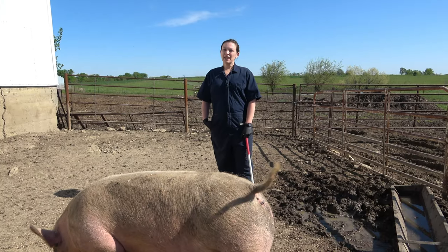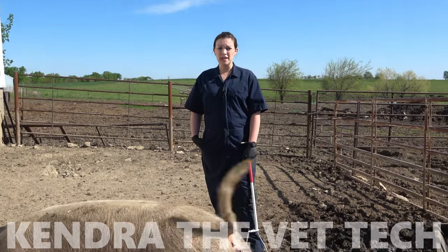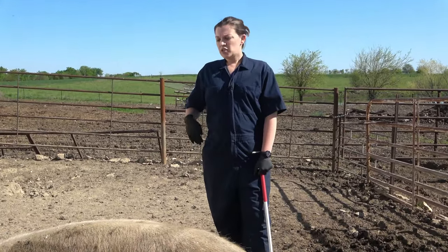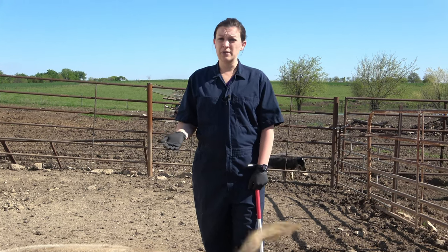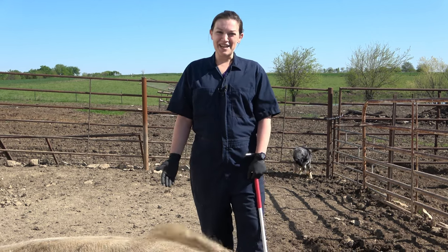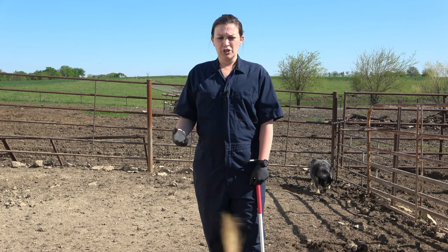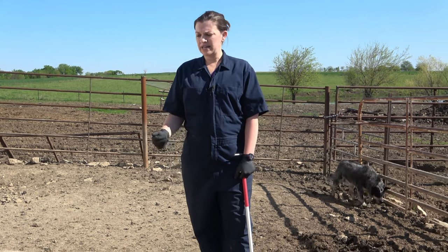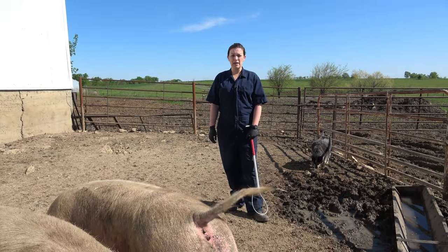Hey everybody, Kendra the vet tech here, and today we're gonna talk about IV catheterization on a pig. With pigs, the easiest place to place their IV catheter is their ear vein. You can, and I have done it on a leg before, but because of their anatomy, they're so fat and their musculature is so large that it's usually pretty difficult to get it into a leg. So your best bet is their ear. So that's what we're gonna go over today, how to place an IV catheter in a pig ear.